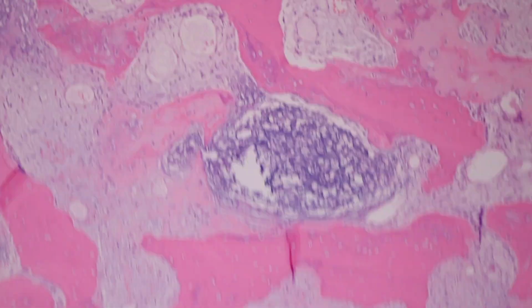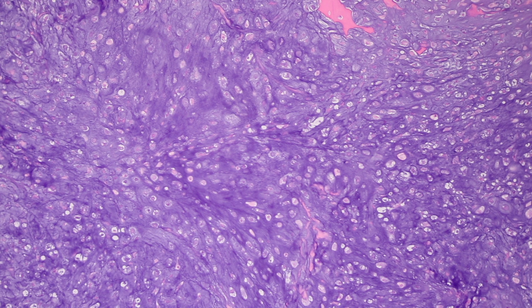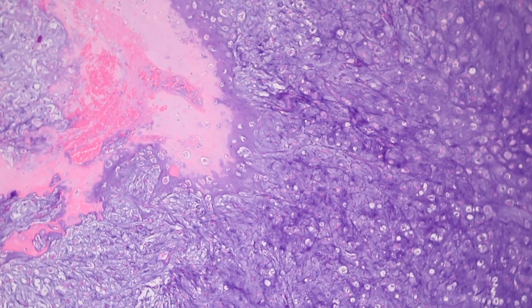And what criteria do you use for grade 3? So for grade 3, imagine, not necessarily spindle, but imagine any high-grade sarcoma: dense cellularity, severe cytologic atypia, mitotic activity. Generally, with grade 1 you generally do not see a mitosis. Grade 2, you're lucky if you see a mitosis. Grade 3, mitotic activity is easily found. And so is this an example of what you're talking about, larger open chromatin, much bigger than the little nuclei that look like lymphocytes?